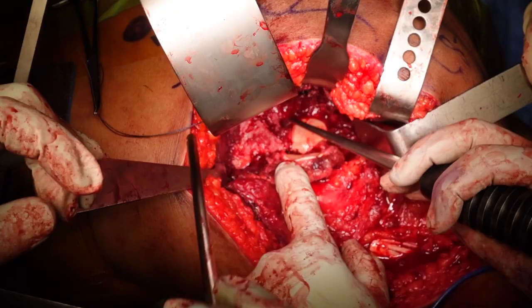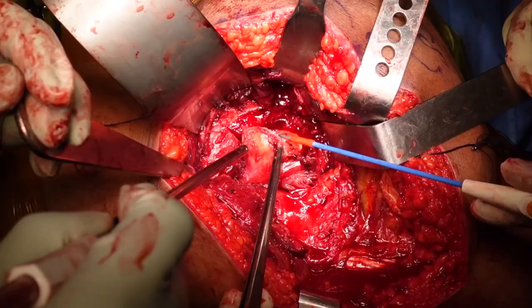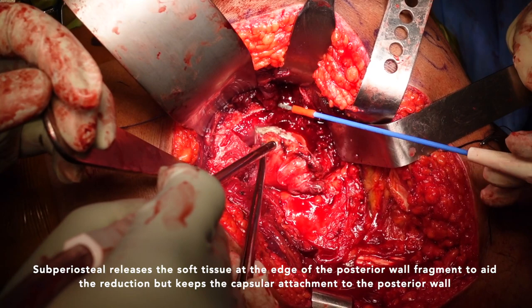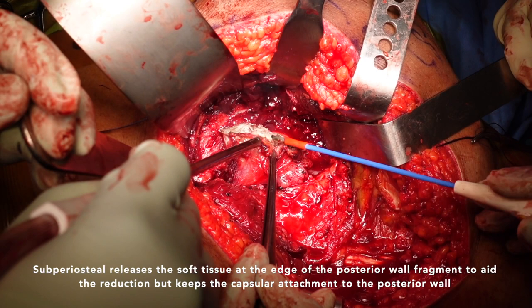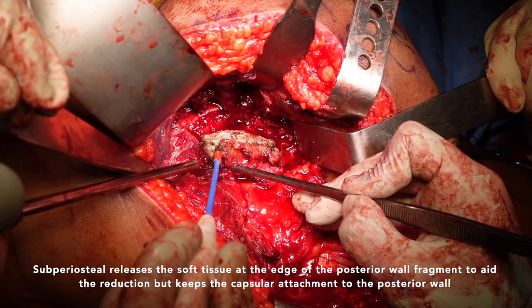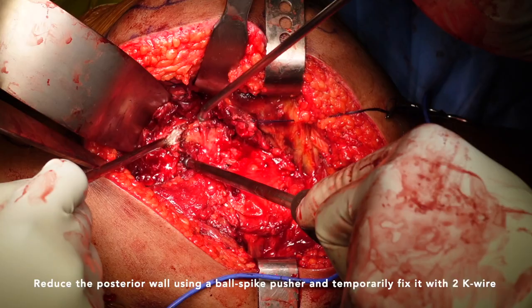The fracture site of the posterior wall is meticulously cleaned for anatomical fracture reduction. Subperiosteally release the soft tissue at the edge of the posterior wall fragment to aid the reduction, but keep the capsular attachment to the posterior wall. Reduce the posterior wall using a ball spike pusher and temporarily fix it with 2 K-wire.